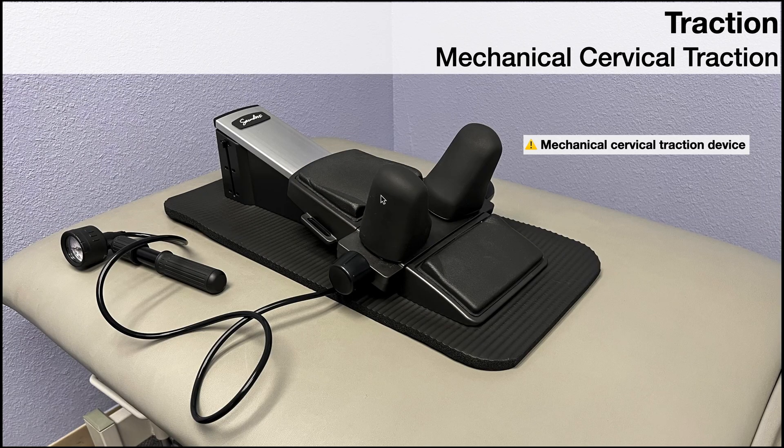Here is the mechanical cervical traction device. There is a separate device for the lumbar spine — you can also use that for the thoracic spine, but it's better suited for lumbar. For the cervical traction device, the person is going to be positioned in supine, laying on their back, with their head on this pad so their neck is between these two black neck pieces.